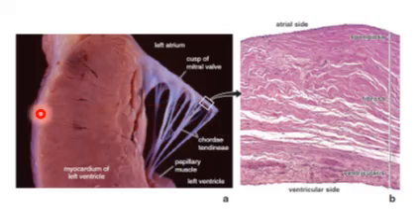This is the wall of the heart. It contains the very tiny layer, which is the endocardium, the epicardium, and the bulk of this will be composed of the myocardium or the cardiac muscle fiber. And the histology of the cardiac muscle fiber was stated previously. This is a structure you have come across during the gross anatomy lecture, which is the papillary muscles and the chordae tendineae, which hold the cusp of the valve in position and participate in the competency of the two atrioventricular valves, the tricuspid and the mitral valve.